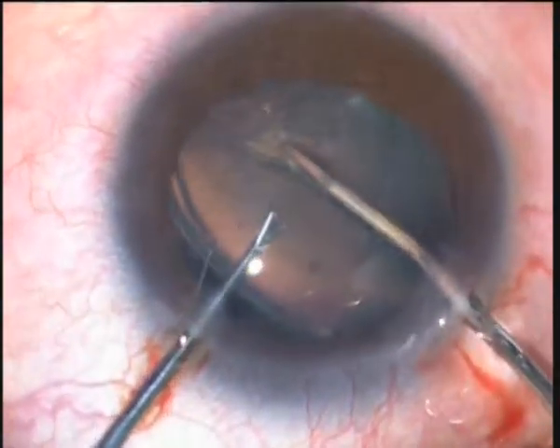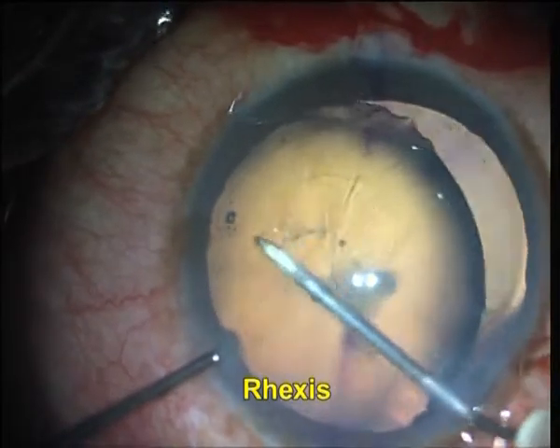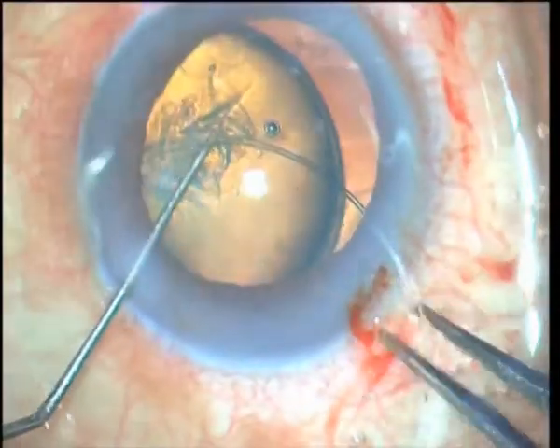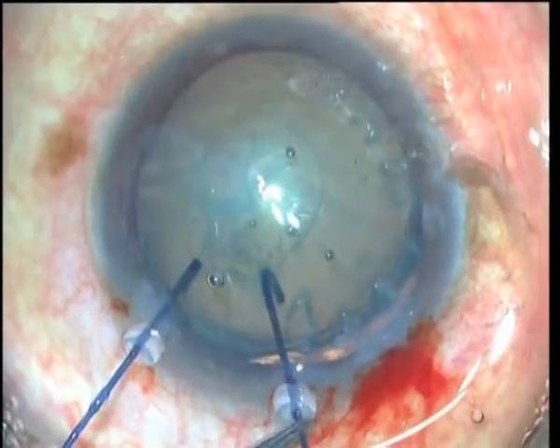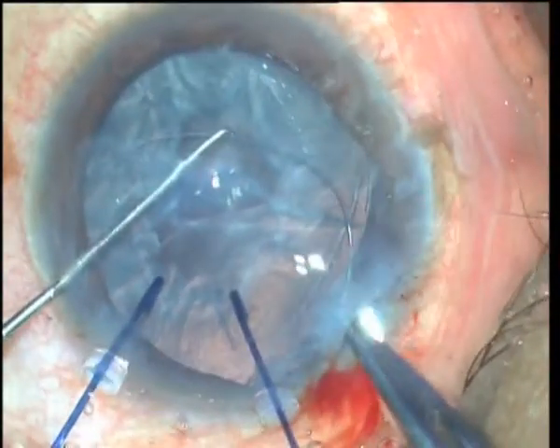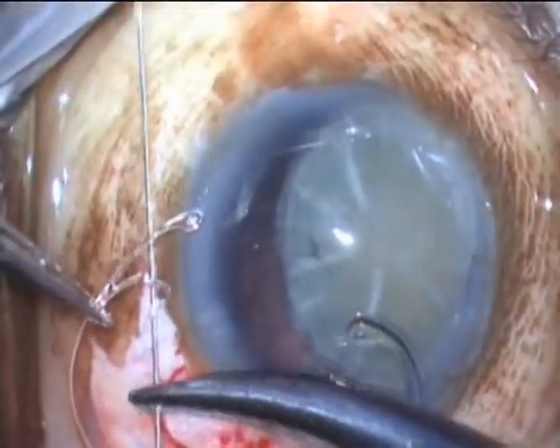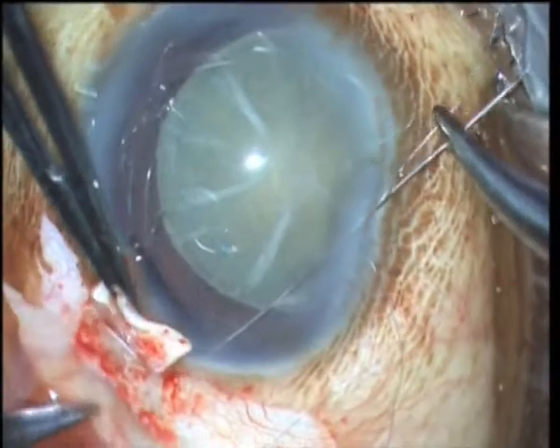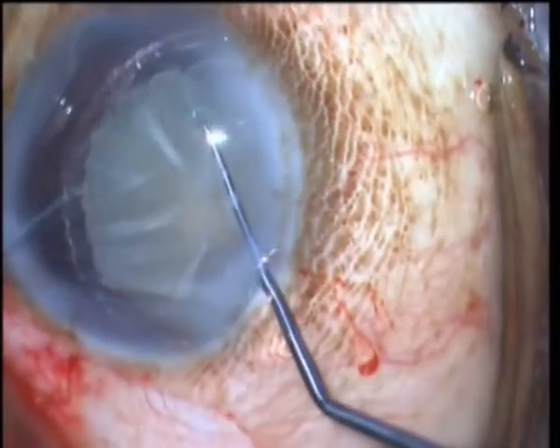Subluxated cataracts are challenging at every step, right from construction of capsulorexis to IOL insertion. The greatest concern, however, is stabilization of the bag during and after surgery. Greater surgical expertise required, longer surgical time, suture-related problems, and delayed IOL subluxation are limitations of suture fixation of the capsular bag to the scleral wall.